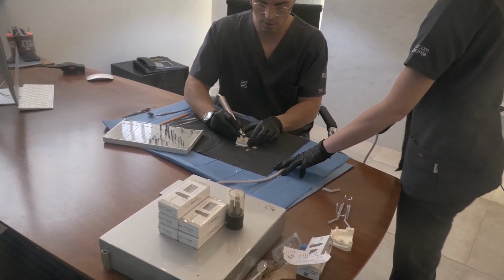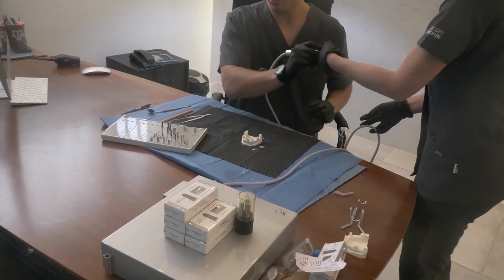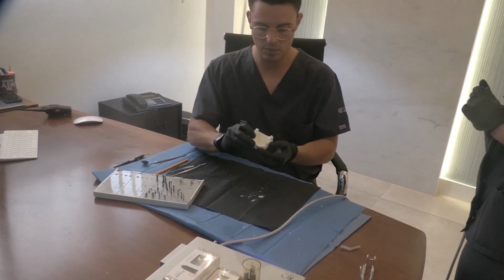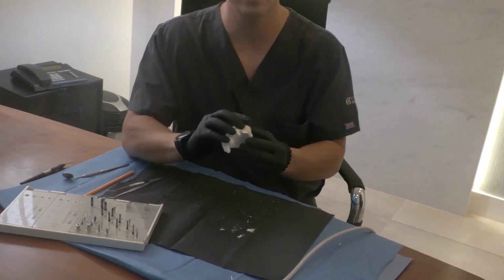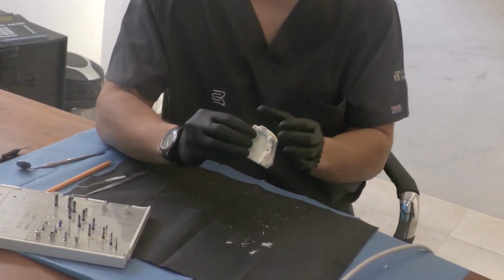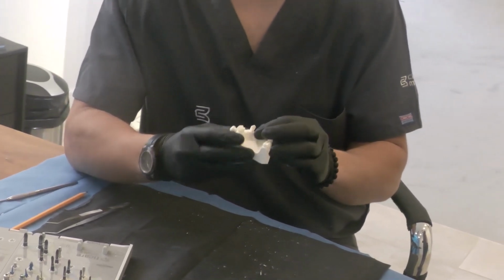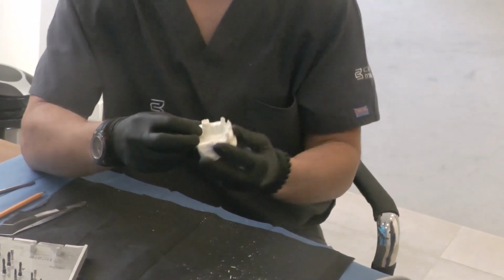There we go. Okay, perfect. Okay, time for implant placement. Again, you can check the recipient site and how it has been prepared according to the standards. But in case that you have a thin buccal bone because of the collapse of the buccal area, you can always apply the principles of guided bone regeneration simultaneously.